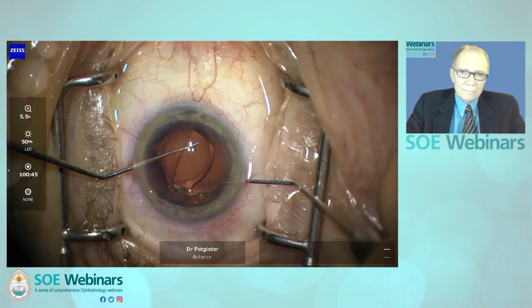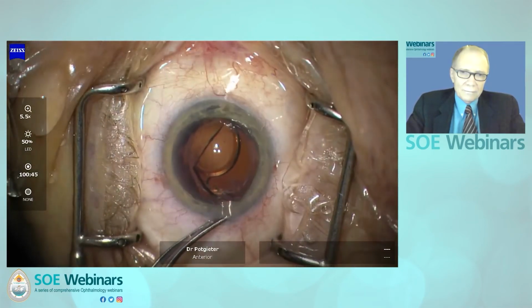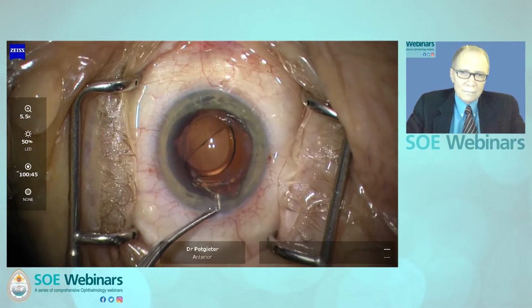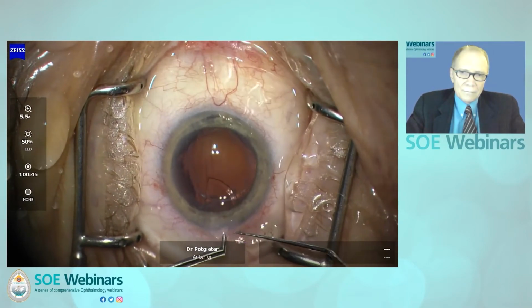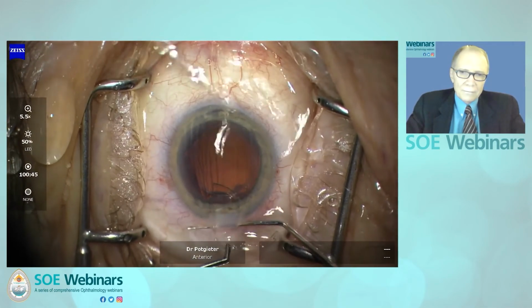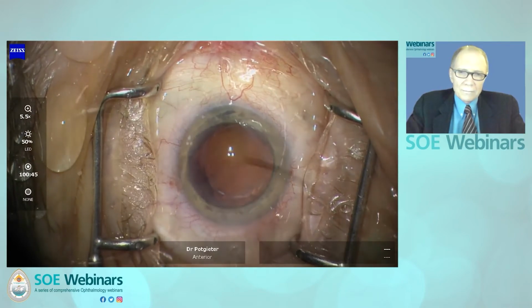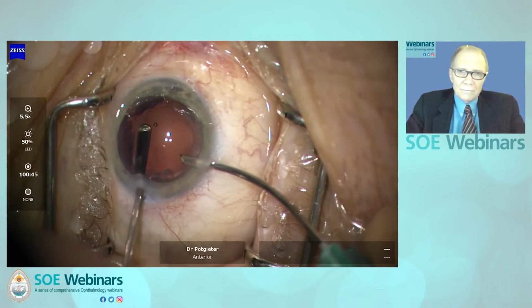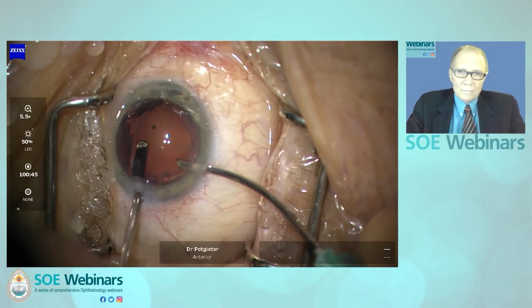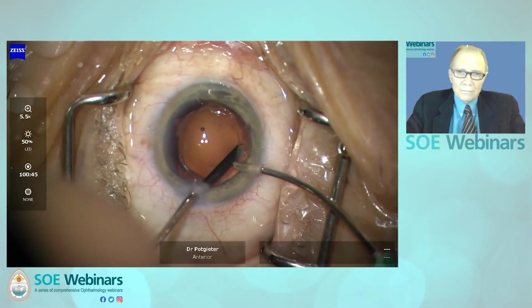Utilizing two Osher-Fenzl hooks through the two paracenteses, the remaining part of the optic was positioned so as to allow its removal from the anterior chamber without losing it into the posterior chamber. Along with the extraction of the optic, vitreous appeared in the main incision. A bimanual anterior vitrectomy was then performed with the infusion through the inferior paracentesis and the vitrector through the main incision.